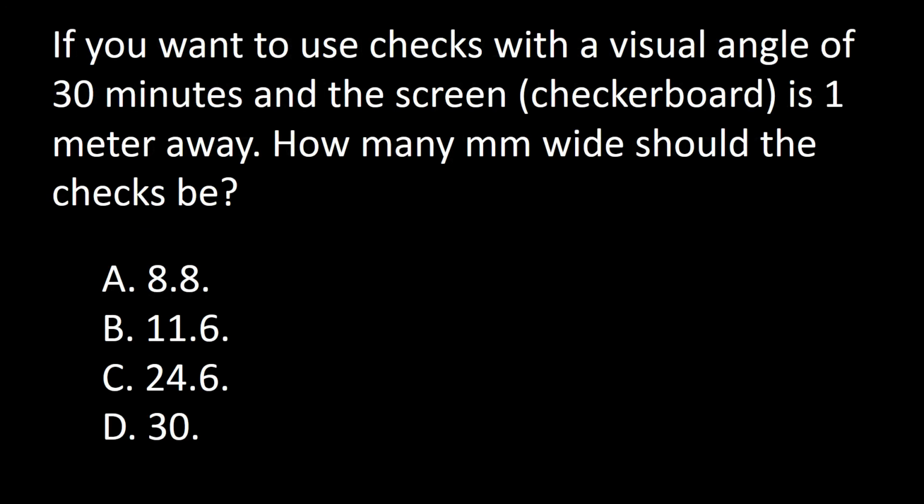Next question. If you want to use a check with a visual angle of 30 minutes and a screen is 1 meter away, how many millimeters wide should the checks be? A, 8.8, B, 11.6, C, 24.6, D, 30.